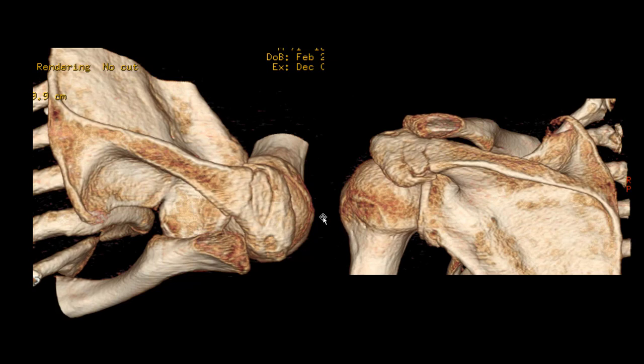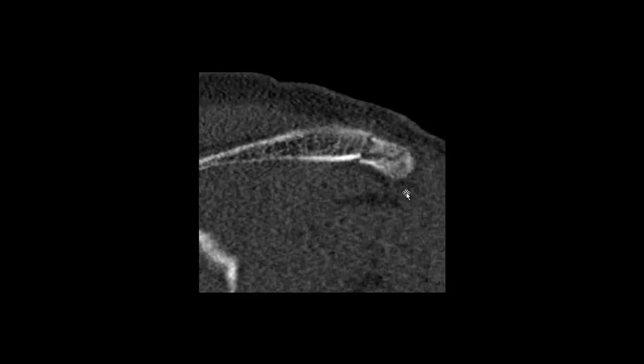This is a 3D CT scan — this is the top view. You can see the fracture over there. This is the posterior view. You can see it is a little comminuted and displaced downward.